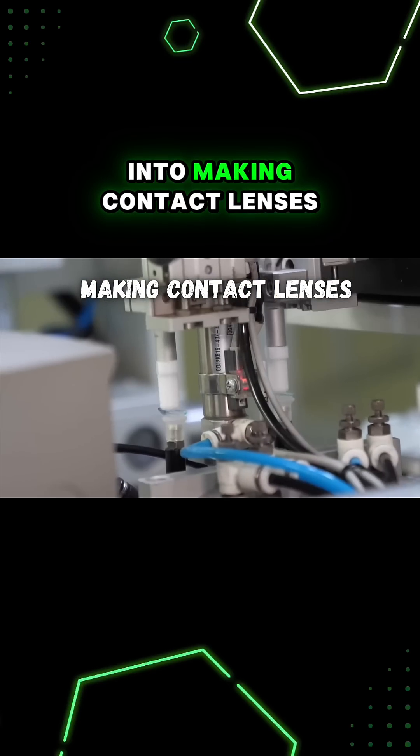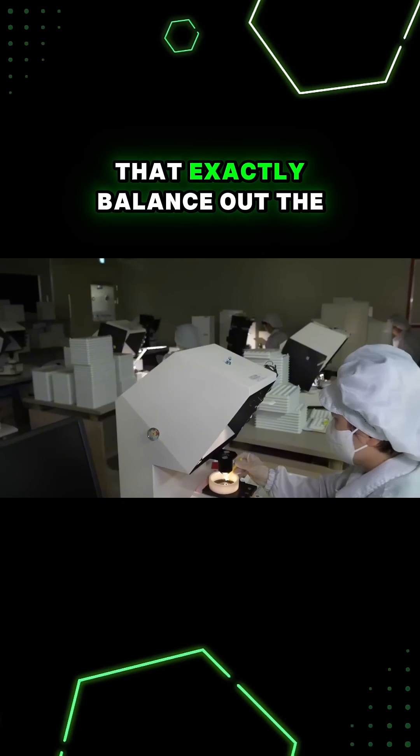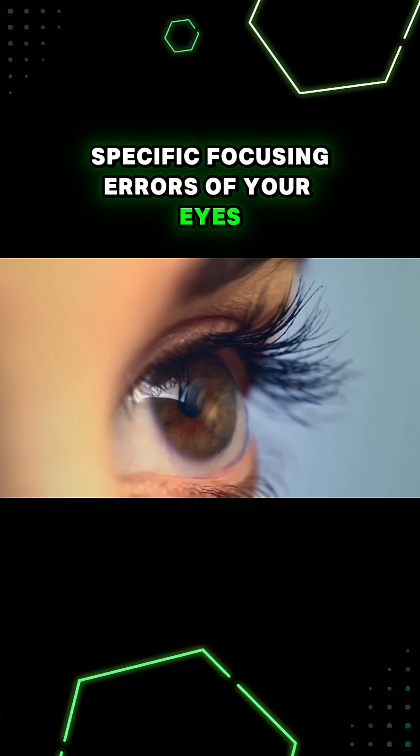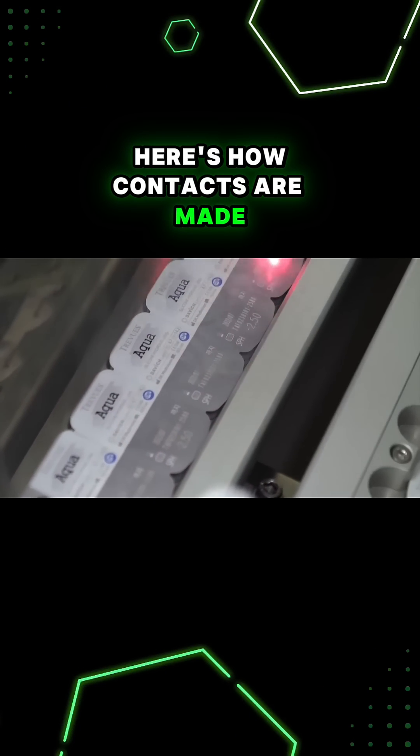A lot of work goes into making contact lenses that exactly balance out the specific focusing errors of your eyes. Here's how contacts are made.